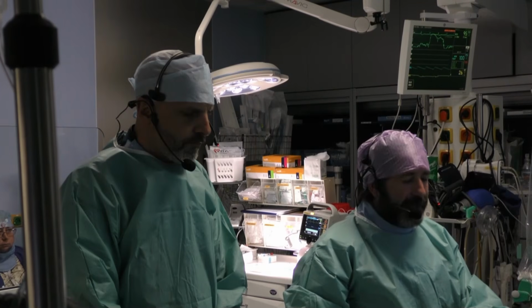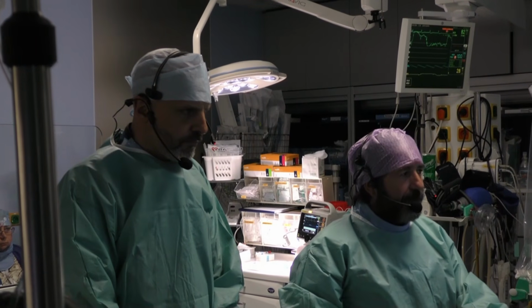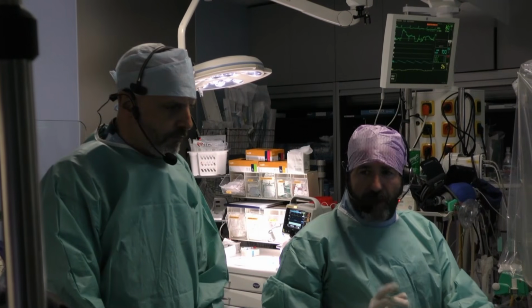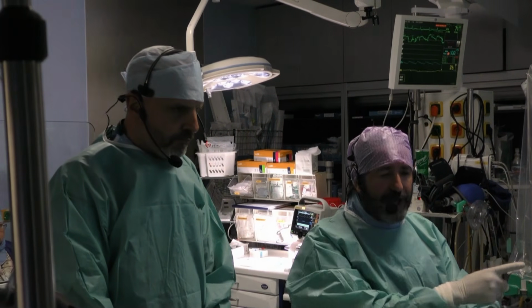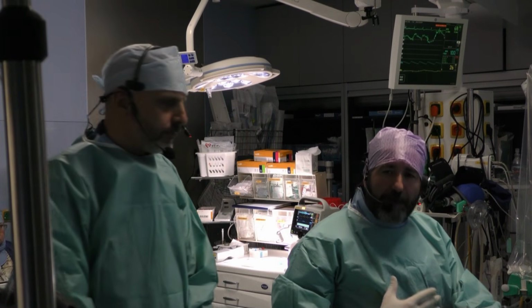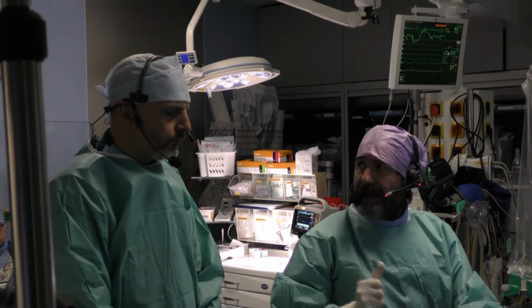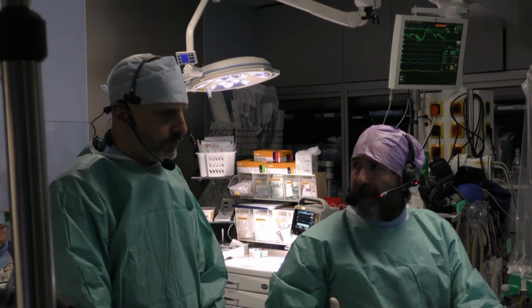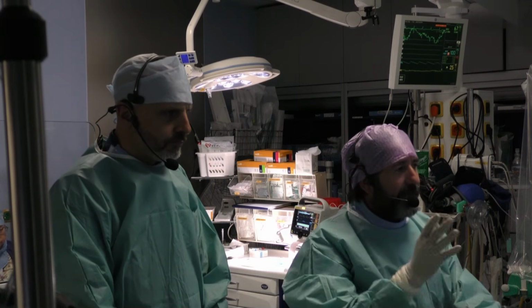Yeah, I think, however, Magdi, my fear with this kind of remap, that I'm not fully convinced that it's enough, is that I think it's almost impossible to create a line of block in the ventricle. So when I see this kind of map, I convince myself it's a line of block, but my feeling is that there is some kind of epicardial connection also that obviously we're not going to ablate today because he is not inducible.